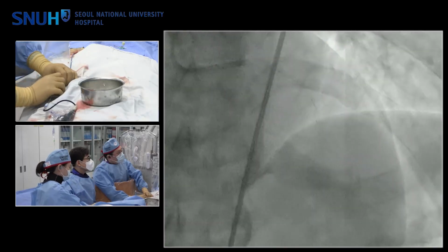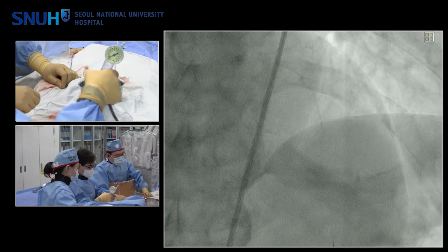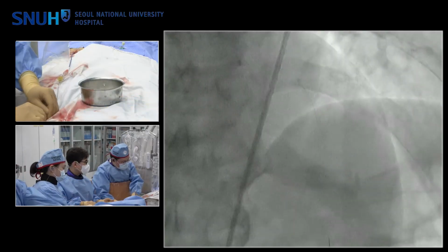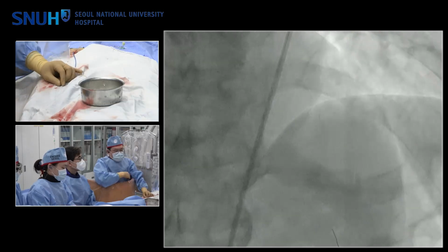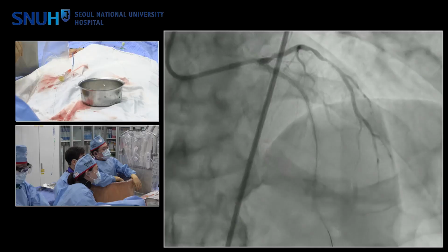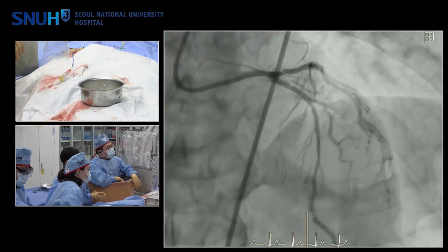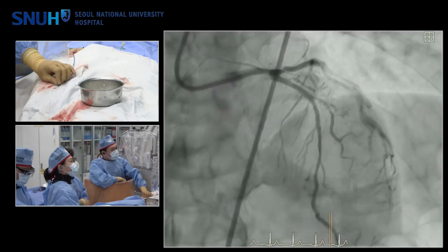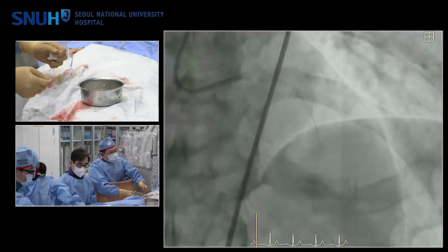The other thing about IVL is that 20 pulses a lot of the time doesn't work. I'll just share some of the experience since we started in 2019. In the year we started, we had 1.9% of cases. This year, we crossed 5.6%. And a lot of the cases are combination cases nowadays, about a quarter with rotoablation and IVL. So we use a smaller rotoablation and then OAS followed by IVL. It shouldn't be redistributed 20 pulses each. You should concentrate more pulses.